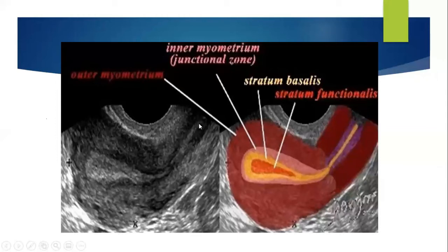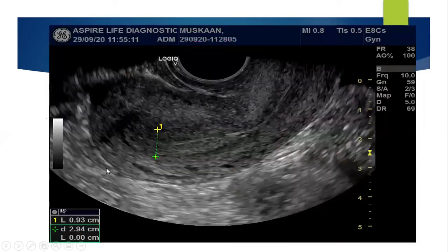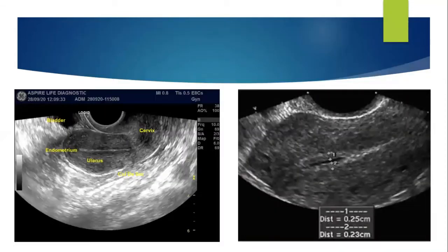And as I told you, from the cervix, we have to keep seeing the endometrium. We have to identify the thickest portion and take the measurement from one white line to another white line in the mid-sagittal section. So extremely important. See this transvaginal scan, mid-sagittal section of the uterus, triple line endometrium, and from one white line to another white line, we have to do the measurement. You all can see the menstrual phase, thin endometrium. In fact, without measuring, I can say this is about maybe 2 millimeters.